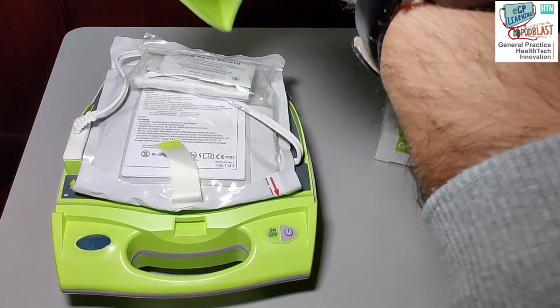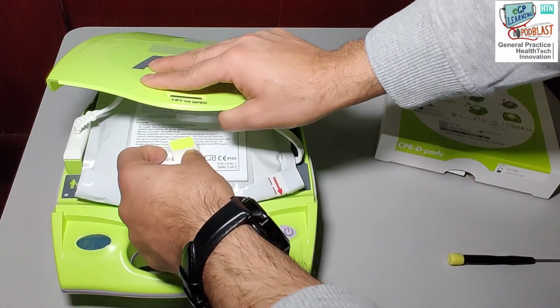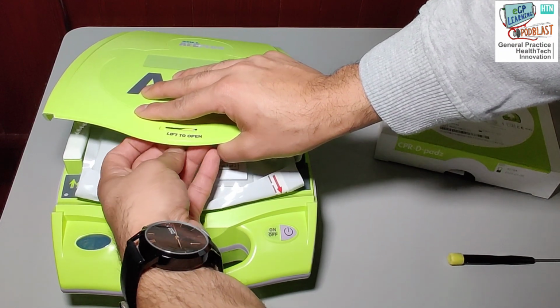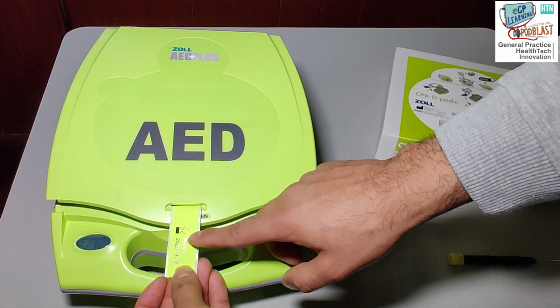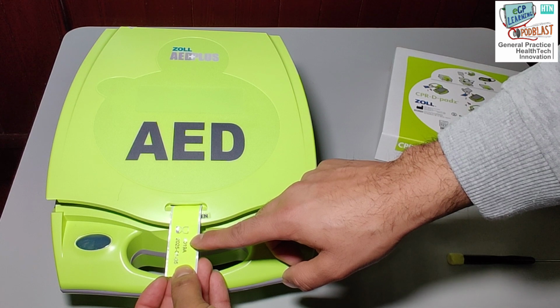Finally, when you're replacing the lid, it does take a little bit of effort because of the extra mass, but also make sure you feed this tab through. This is for two reasons. It makes it easier to open the device, but also it displays the date of the pads, so it's much easier to check when the pads need renewing.